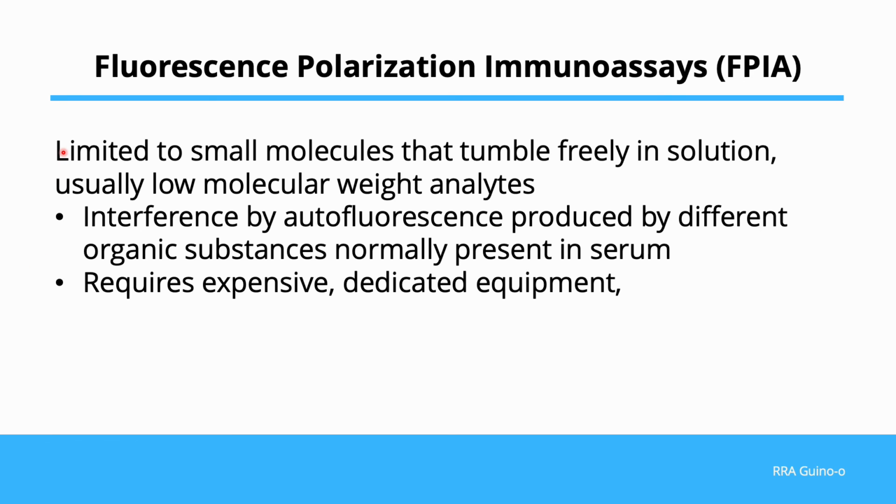Because of the nature of FPIA, it is limited to detecting small molecules that are able to tumble freely in solution. Usually, these are our low molecular weight analytes. Aside from that, FPIA also has some inherent disadvantages. Because there is no washing step, there is a chance of interference by autofluorescence produced by different organic substances normally present in the serum. In addition, FPIA also requires expensive and dedicated equipment.